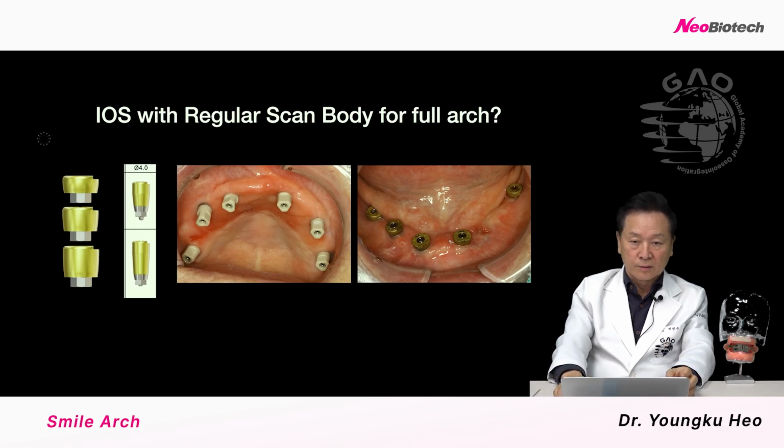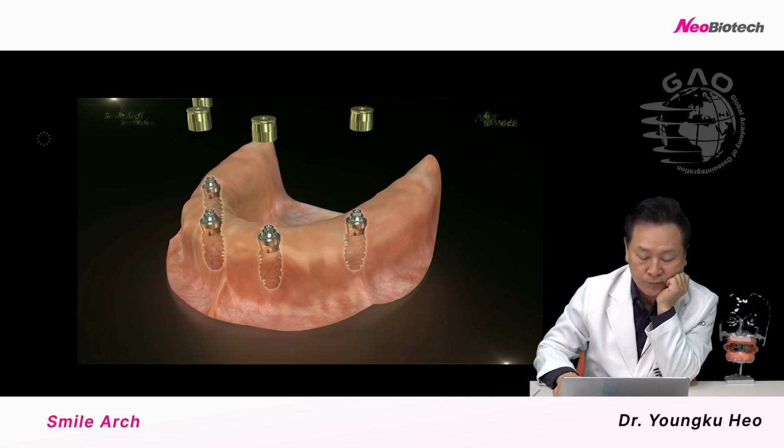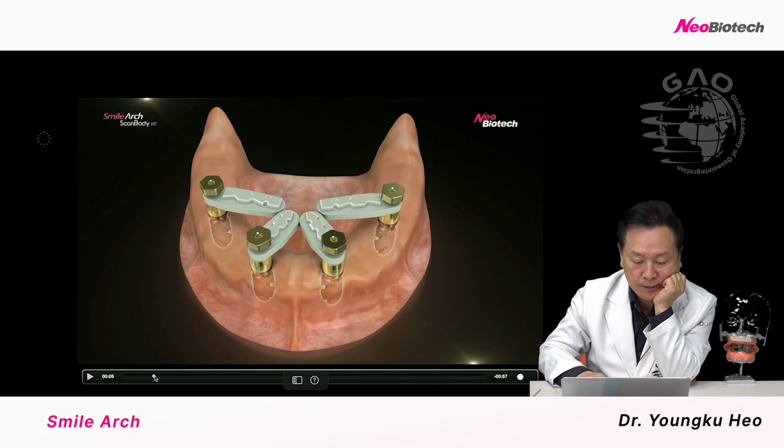There is a lot of distortion. So we developed a very special intraoral scan body. We call it the SmileArch scan body. For example, you see here.